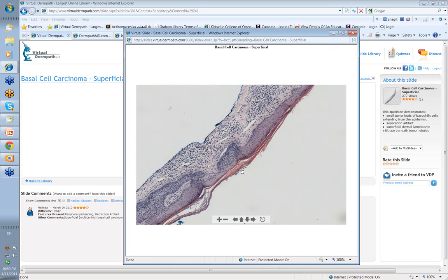And it's a classic feature of some pigmented BCCs. So, the major things to note: the peripheral palisading. Sometimes you get a little bit of clefting as well, which is separation of the buds of the groups of cells budding off that basal layer of the epidermis from the underlying stroma. There may be a bit of an inflammatory infiltrate there as well.